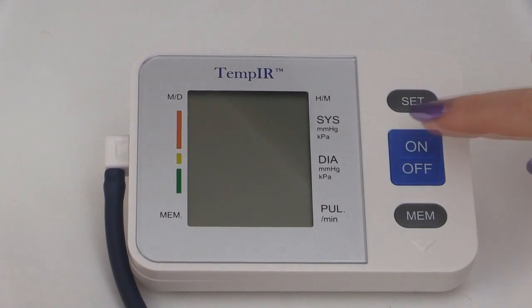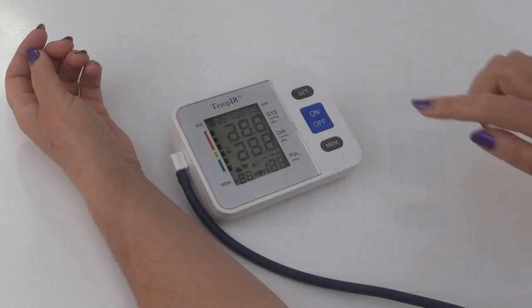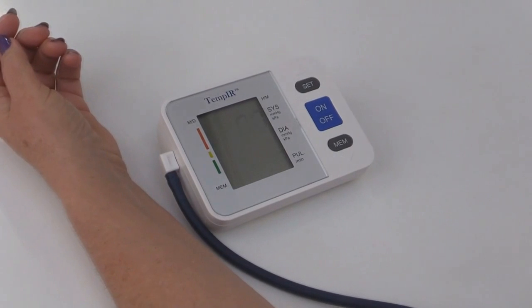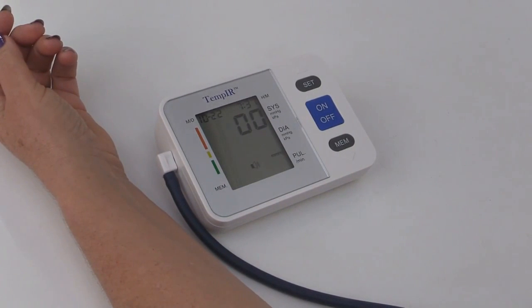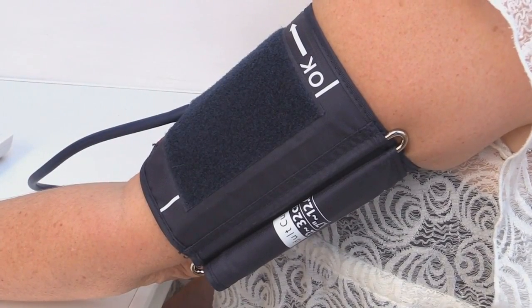Press the on/off button. The monitor will prepare to take the measurement — this will take a few seconds. Whilst the measurement is being taken, keep absolutely still and don't talk. Maintain the cuff and heart at the same height. The cuff will begin to inflate.